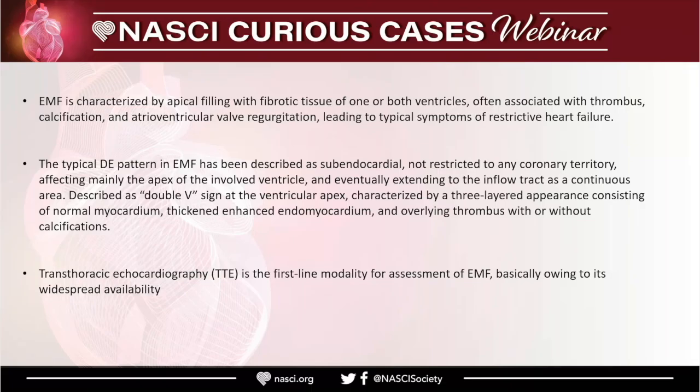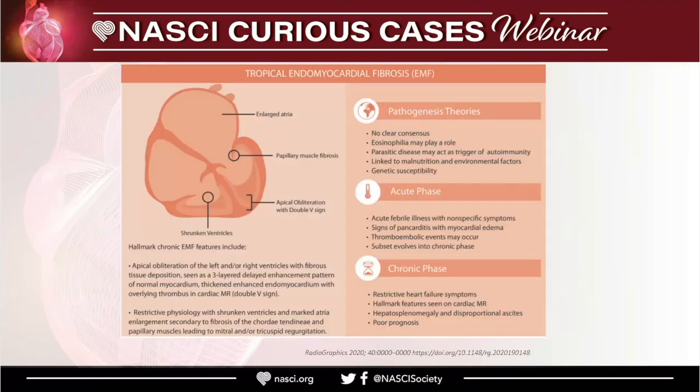And as echo is very readily available, it's basically the first modality, and we get some basic information with it that shows an echogenic mass or an echogenic structure filling up the ventricular cavity. And with all that information, the patient comes to us for further workup.